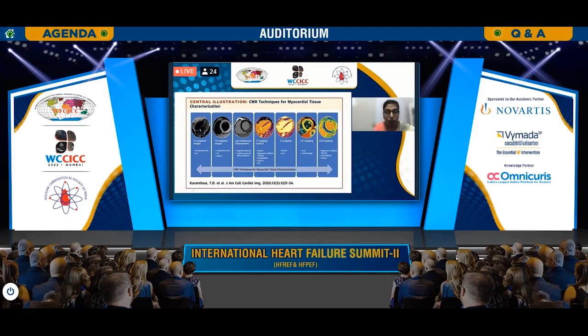We have T1 weighted sequences, T2 weighted sequences, which give you tissue characterization and pick up edema. We have late gadolinium enhancement, which, as I told you, can pick up scar. Now, since the last 4-5 years, we also have parametric mapping. Namely, we have T1 mapping, which is used for picking up fibrosis; T2 mapping, which allows us to see edema better; T2 star mapping, which can help us pick up iron and hemorrhage. And then we have ECV. So ECV can be useful wherever there is diffuse infiltrative cardiomyopathy or there is diffuse fibrosis.